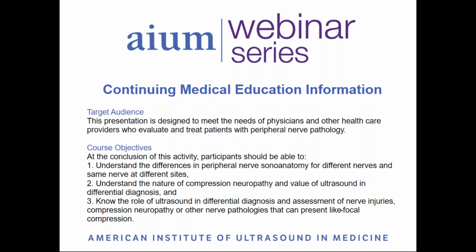By the conclusion of this webinar, participants should be able to understand the differences in peripheral nerve sonoanatomy for different nerves and the same nerve at different sites, understand the nature of compression neuropathy and the value of ultrasound in differential diagnosis, and know the role of ultrasound in differential diagnosis and assessment of nerve injuries, compression neuropathy, or other nerve pathologies that can present like focal compression.